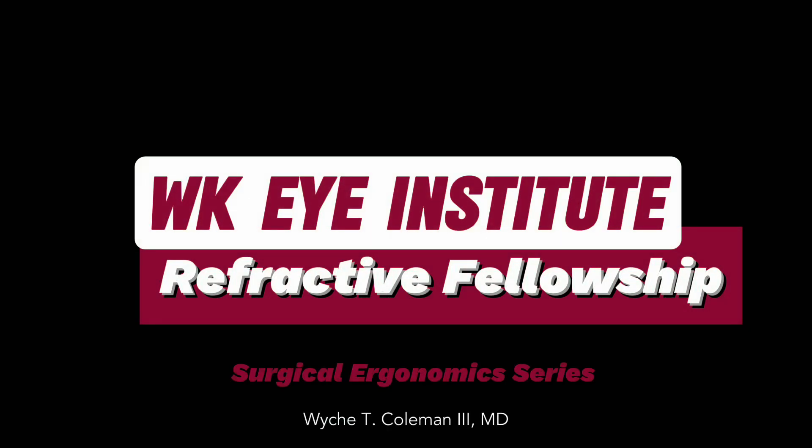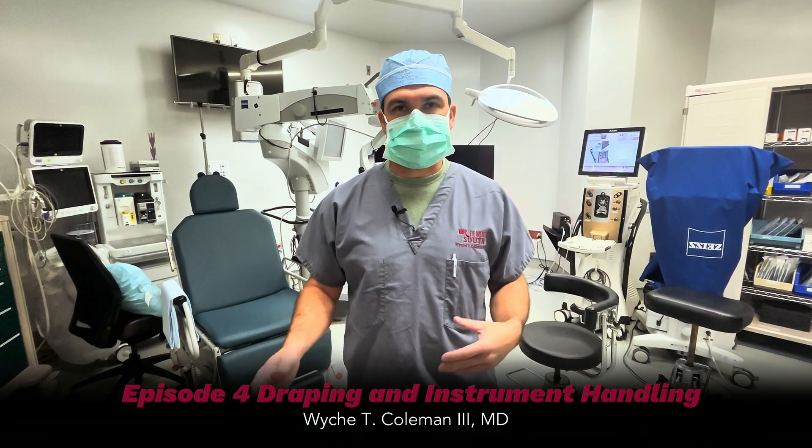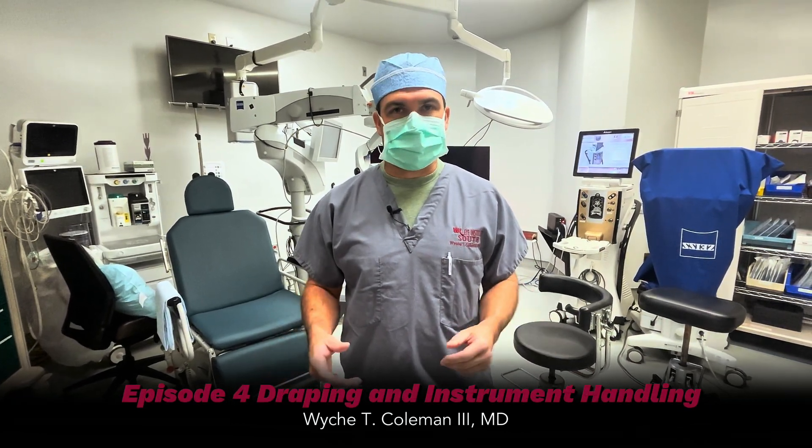Hey everybody, I'm Dr. Weitz-Coleman. We're going to go over a few things that I think are under-emphasized points. I think it'll help you be more successful with your cataract surgery technique if you get a good setup to begin with.